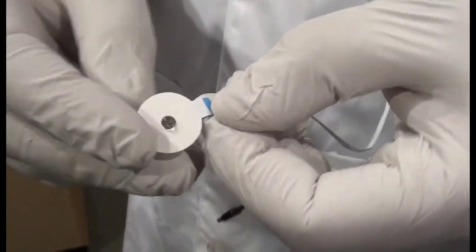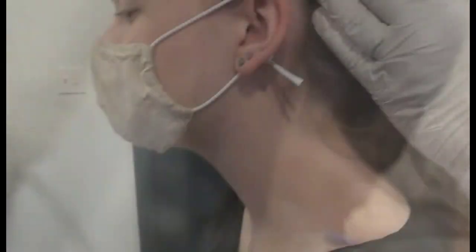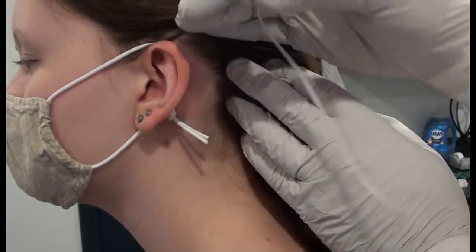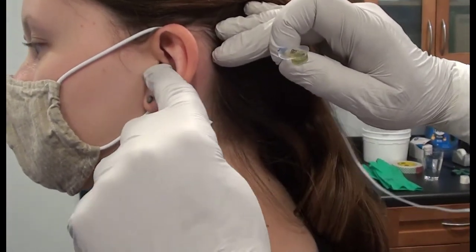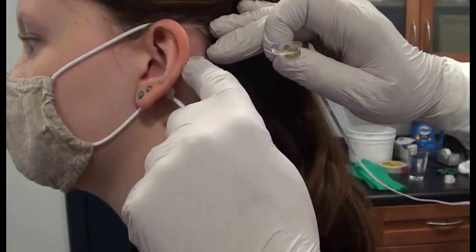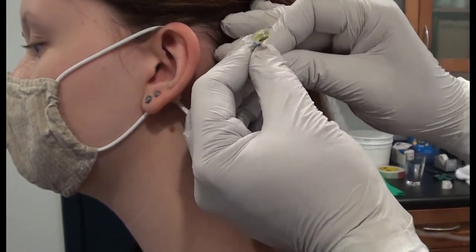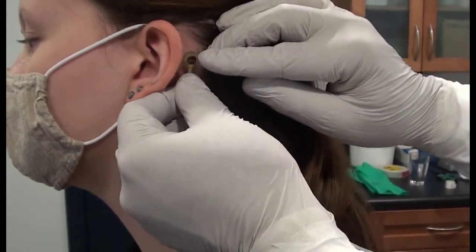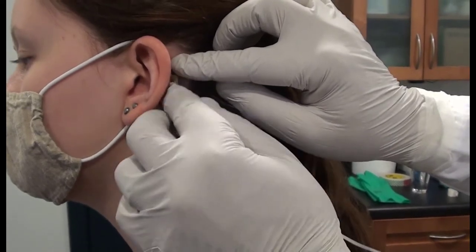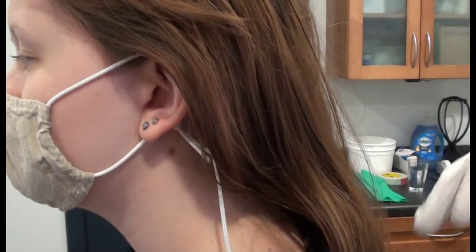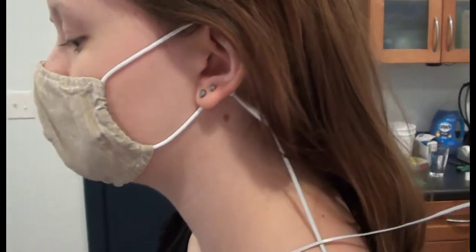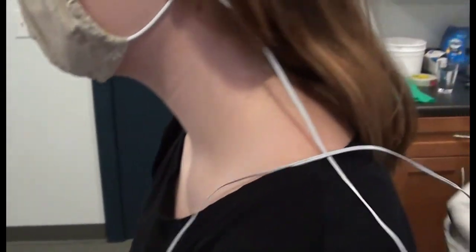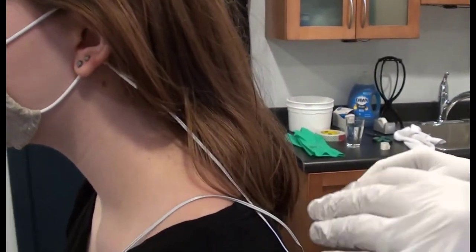If you plan to apply electrodes at the mastoids or earlobes, be sure to do that before you place the cap on the head, especially if the participant has long hair. Once the cap is on the head, it holds the hair down and makes it difficult to clear a path to place electrodes around the ears. If you place flat type electrodes at the mastoids, it's important not to place them too high or too low. Too high will pick up temporalis muscle, too low will pick up neck muscle. If the mastoids are your EEG reference, these large muscle signals can corrupt the EEG.